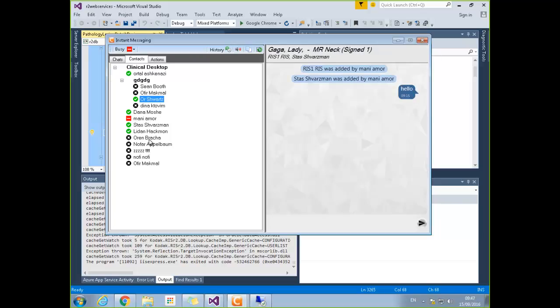But we hadn't really thought of linking into AD. We've kept it inside the world for the moment, easier and simpler to maintain, because these multi-site customers have a lot of users, and if you have to search through everyone, maybe we can give them tools to make it easier. Yeah, to select the right people. Exactly.